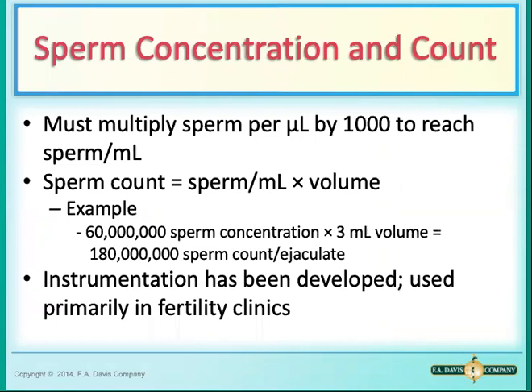Calculations of sperm concentration really depend on the dilution and the size and the number of the squares that you count. Again, we typically count the 4 corner squares and the middle square, so you count 5 squares in total. When you use the 1 to 20 dilution, you will count the large square in the center and then the 4 corner squares.